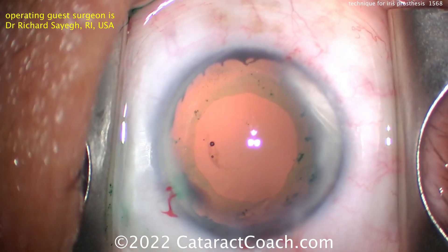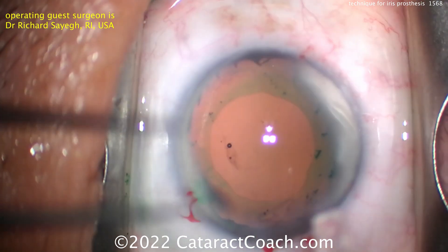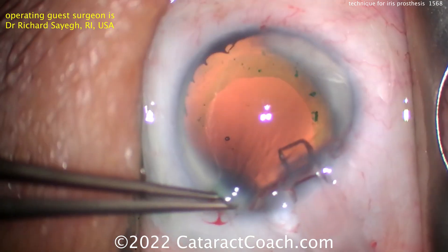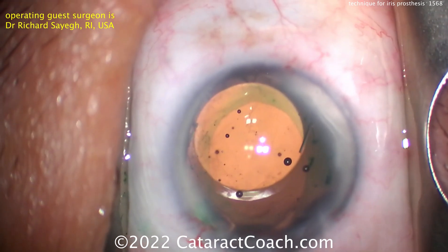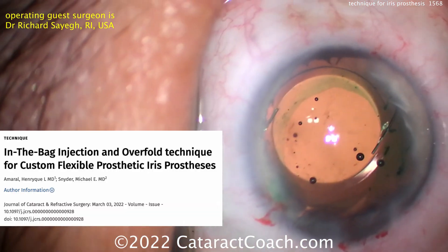A capsular tension ring was just placed inside the capsular bag. Now coming up is the IOL. This patient had some sort of traumatic experience previously, resulting in loss of iris tissue. Here comes the lens — it looks like a three-piece silicone lens, a soft port lens from Bausch und Lomb going into the capsular bag, centered nicely. And now, ready for the iris prosthesis.